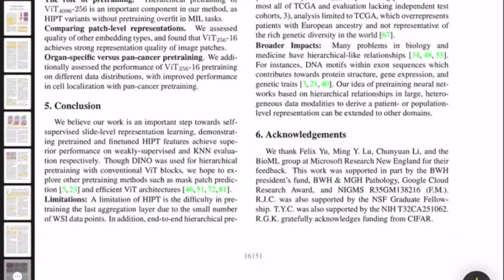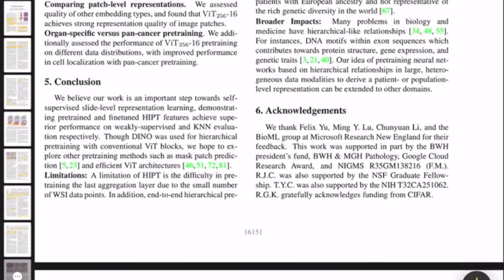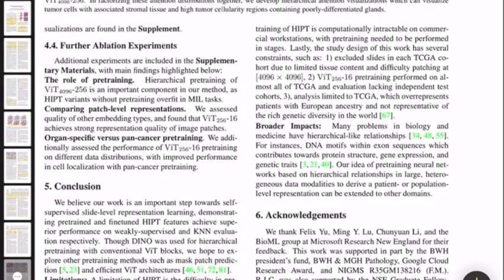In conclusion, this work is very important for computational pathology because of the use of self-supervision in the novel architecture that tackles the size challenge of whole slide images. We saw that the model that learns self-supervised representations still outperforms state-of-the-art supervised or weakly supervised methods.